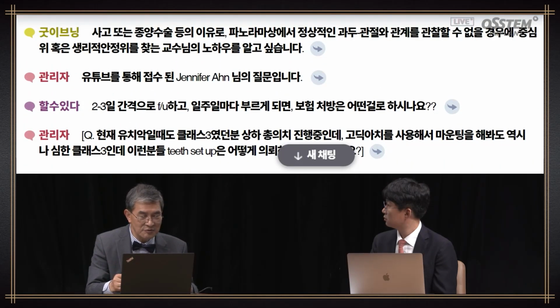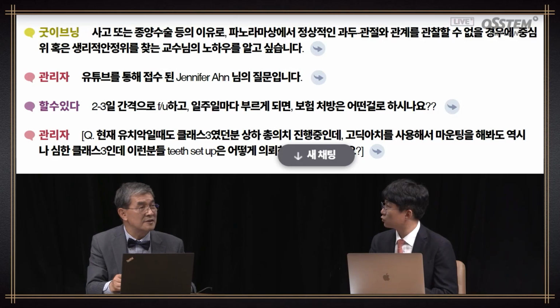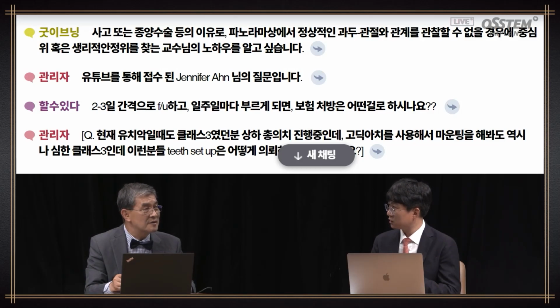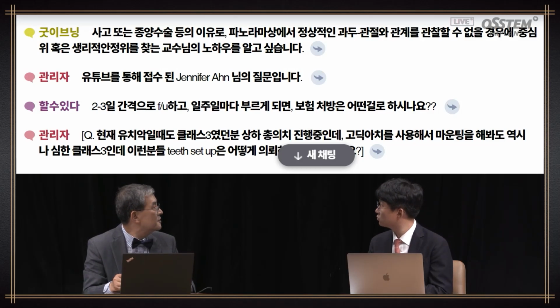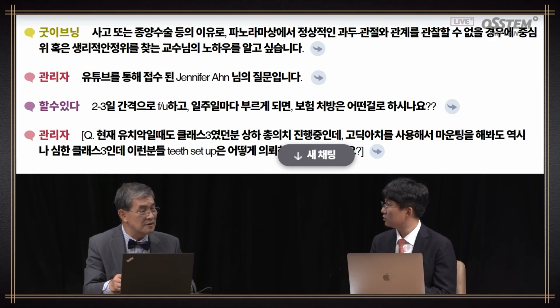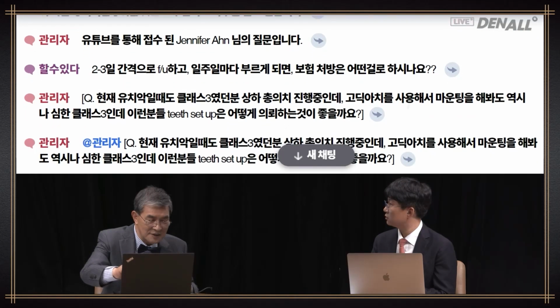Next question from Good evening. Due to accident or tumor surgery, if normal condyle and fossa relationship is not found in panorama, what is your know-how to find the CR or physiological rest position? If there is no condyle due to tumor surgery, there will be no CR obtainment. In a textbook manner, in that condition, condyle rest position with muscle relaxation should be found. As I said before, you need to undergo trial and error.